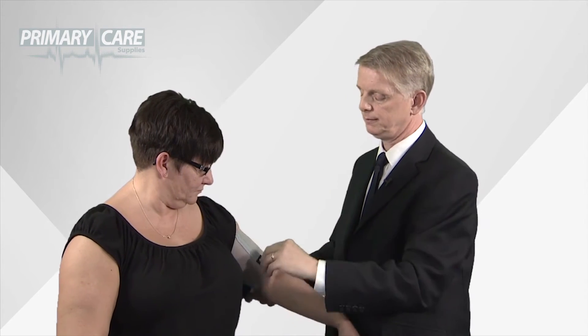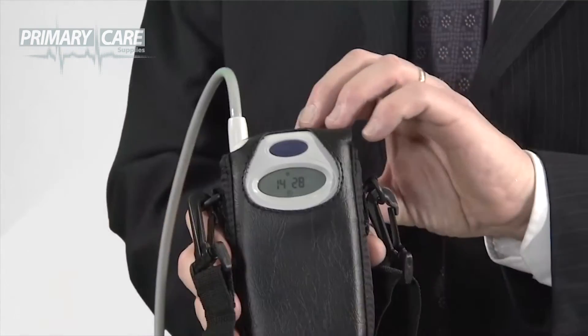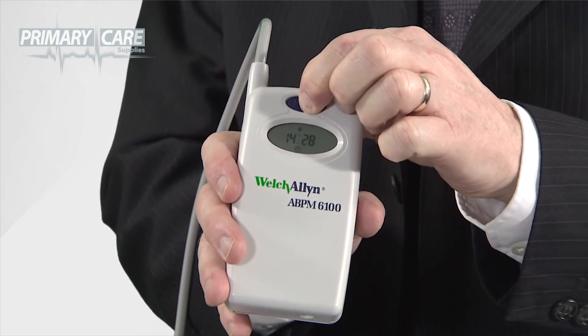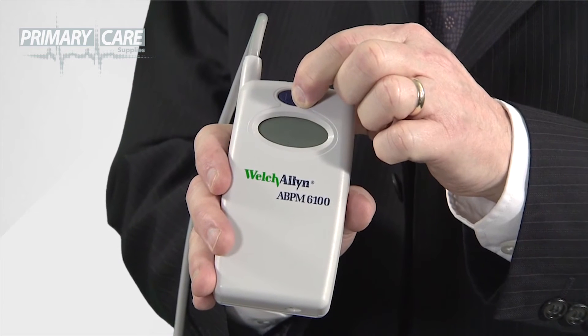Remove the cuff and take the unit out of its pouch. Hold the blue button on the front down for approximately seven seconds, or until the unit bleeps five times — then you've switched the unit off. After that, you can download the results at your leisure.